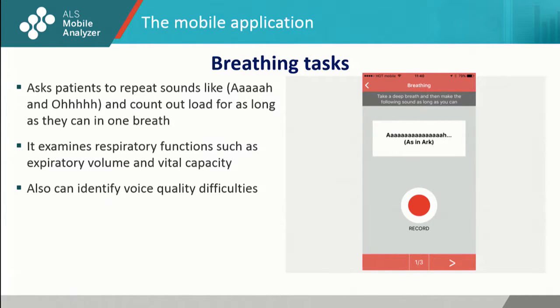Breathing tasks ask patients to repeat sounds like ah and oh, and to count out loud for as long as they can in one breath. It examines respiratory functions such as expiratory volume and vital capacity. Also, it can identify voice quality difficulties.